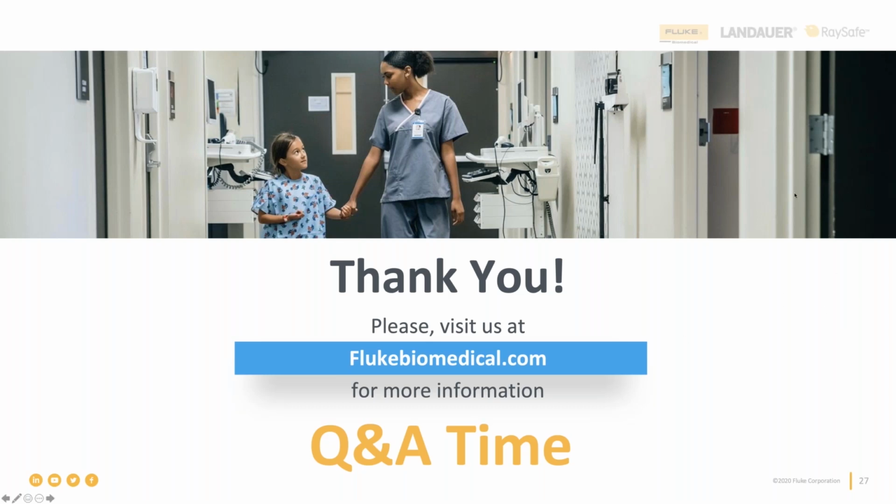So what you're doing with your functional tester is you want to make sure that every year what's measuring the light and what's emitting the light is functioning the way that it should, because that's essentially what the functional tester does. So you want to make sure that the function is verified on a year-to-year basis. There's nothing to calibrate on it because it does all that calculation and interpolation inside of it.